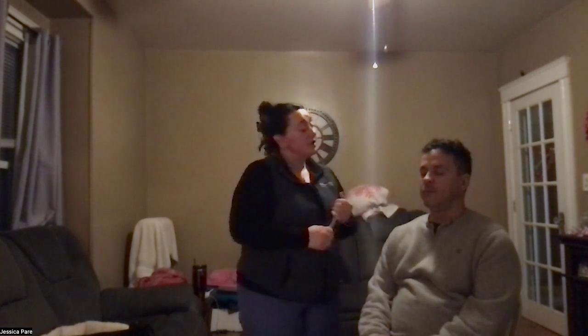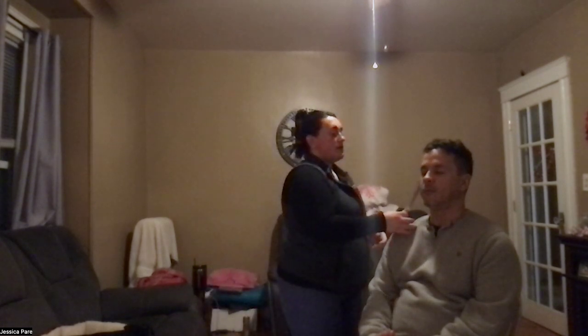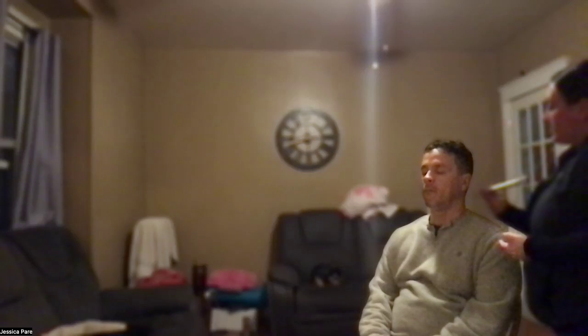I then am going to test for air and bone conduction. That is the Rinne test. I'm going to test by doing two things. First is the air conduction. It will be A, and then bone conduction will be B. You tell me which one is louder to you. Okay. This is A, and this is B. A. Perfect. And I'm going to check the other side. This is A, and this is B. A. Perfect. So his air conduction is louder than his bone conduction, which is exactly what we would like.